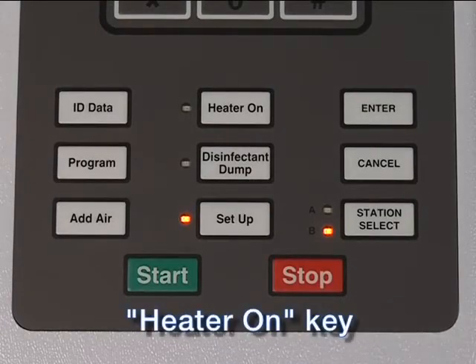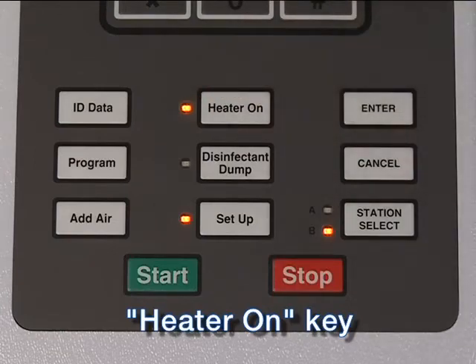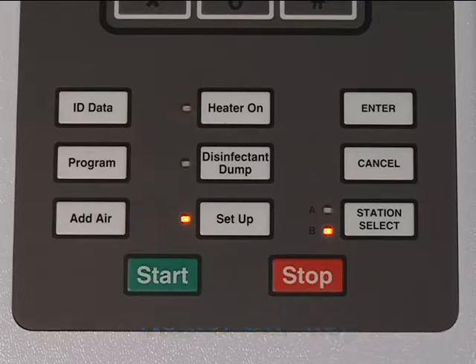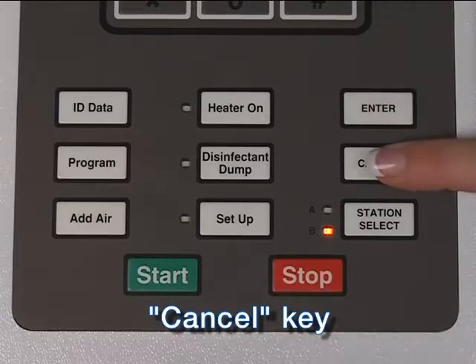The Heater On key toggles the reservoir heater for the selected station on or off; the LED is lit when the heater is on. The heater should always be on when using a chemical that needs to be heated to achieve high-level disinfection. The Cancel key can reject settings, reset an alarm, or abort a cycle. Reject an incorrect user entry by pressing Cancel — the previous value is restored. To abort the currently running cycle, press Cancel then Enter. To reset an alarm, press Cancel then Enter.